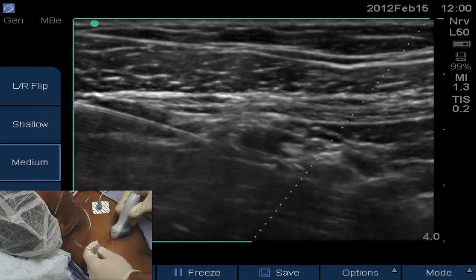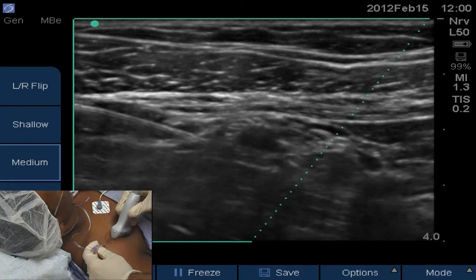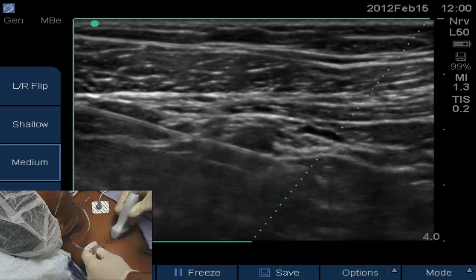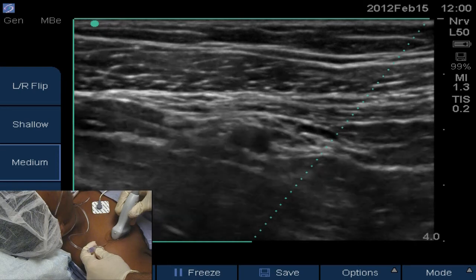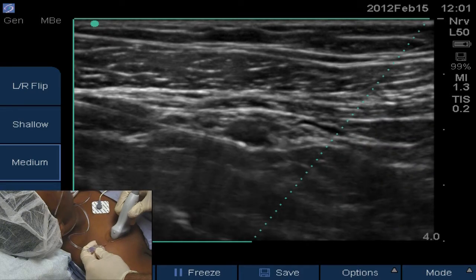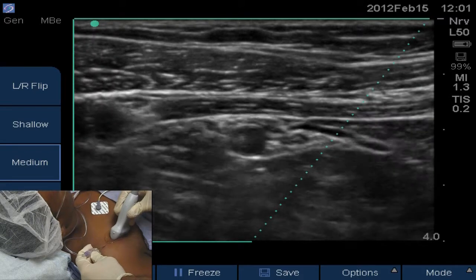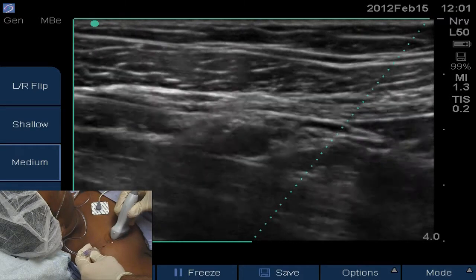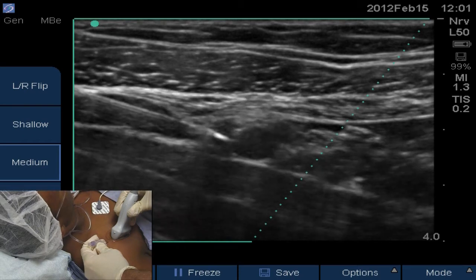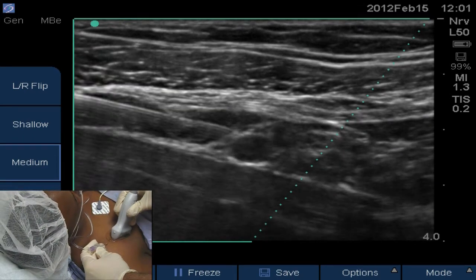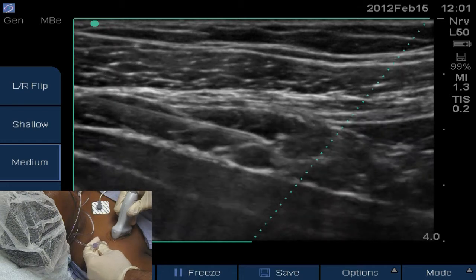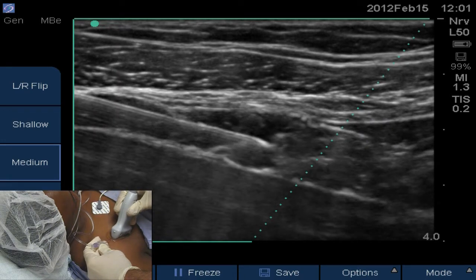Another five. Pull back a little bit, a little closer to six o'clock — aspirate and get another five. Another two — we're going to just target the lateral cord now. Another two. I'm just going to follow my injection over the top of the artery. Two more. That works for me too.